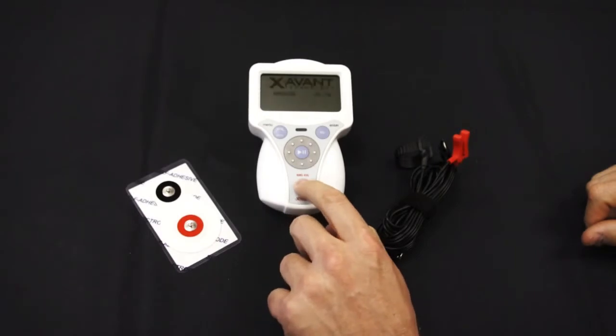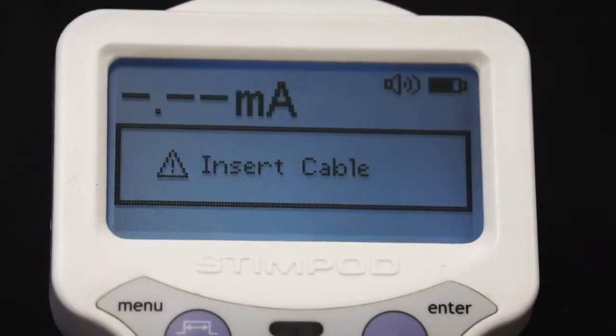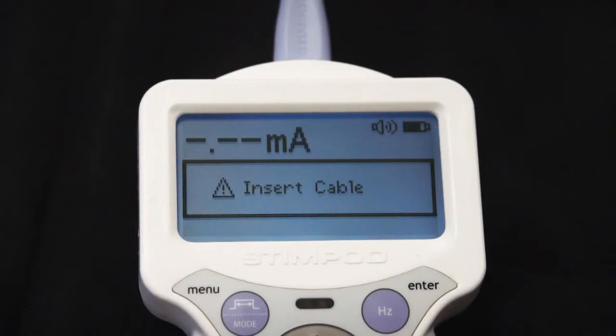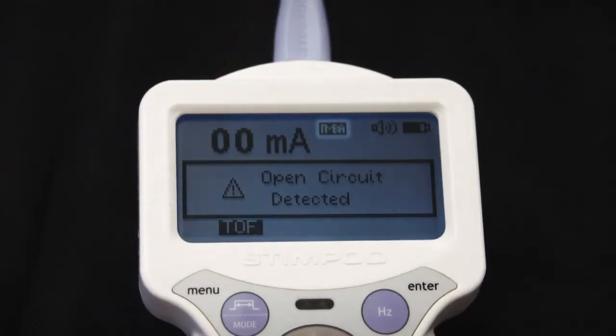Step 1: Switch the Stimpod device on. A warning screen will appear prompting you to insert the cable. Step 2: Insert the cable. The accelerometer light will flicker from red to blue, and a screen alert stating 'open circuit' as well as the NMBA mode icon will appear, and the device will default to TOF mode.